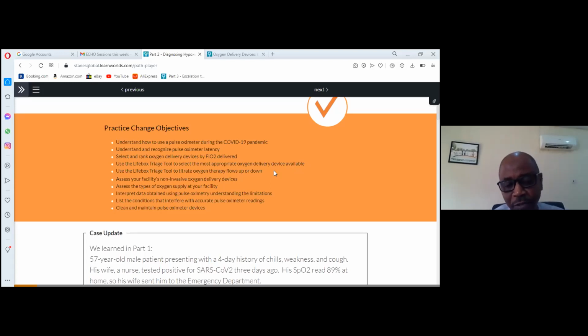Either you escalate or you bring it down, because there is no need, when you are using 2 liters per minute flow and you're getting a satisfactory saturation, to escalate it to 4 liters. You will be wasting oxygen.